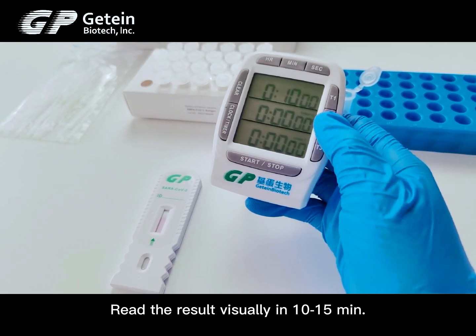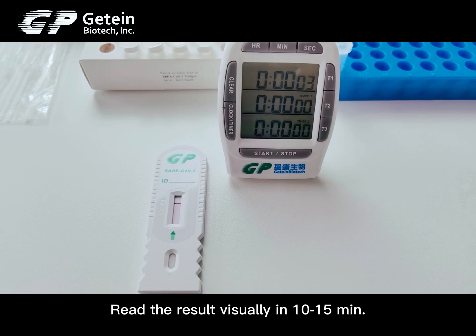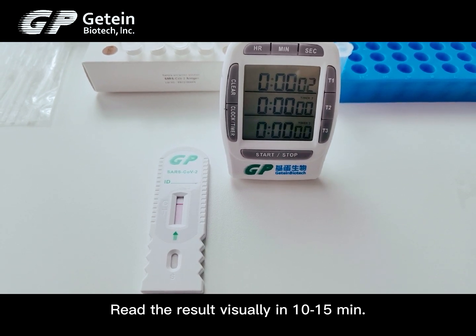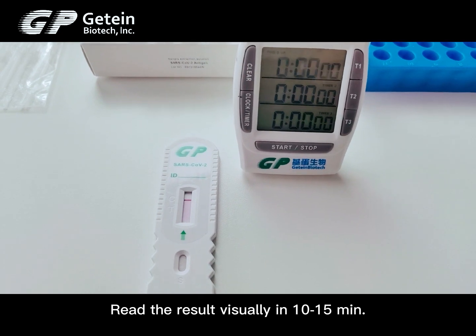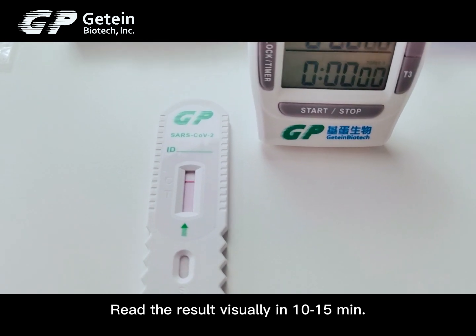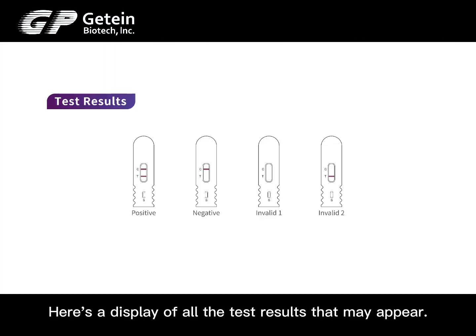Read the result visually in 10 to 15 minutes. Do not read results after 20 minutes. Here is a display of all the test results that may appear.